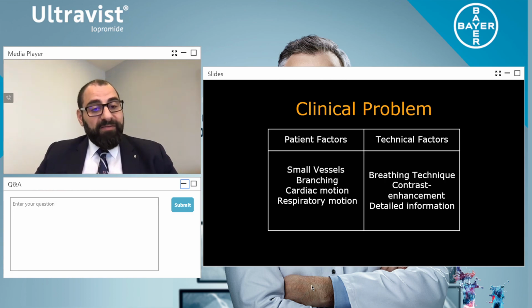We will talk about this a lot more. Now, contrast cannot work on its own. You need to actually couple it with low kVp factors, because with a lower kVp and a high contrast density at 370, you are definitely going to get better image quality and greater opacification profiles within lesions and the liver parenchyma. But more importantly, it's always important to use safe contrast.